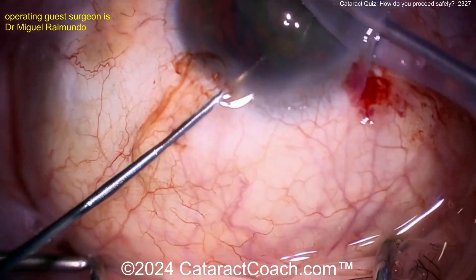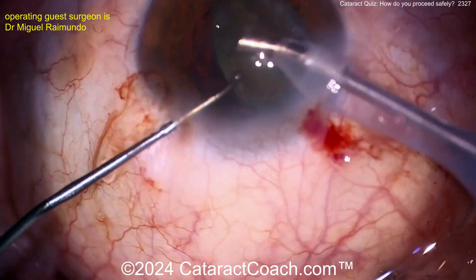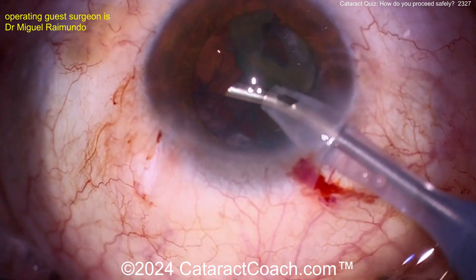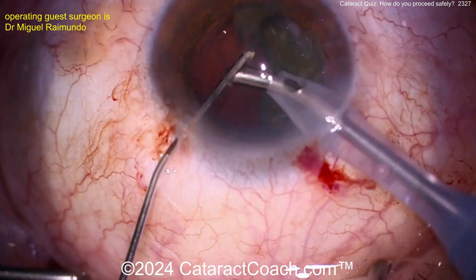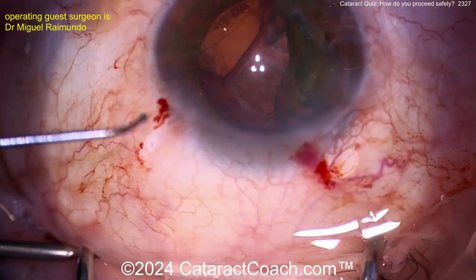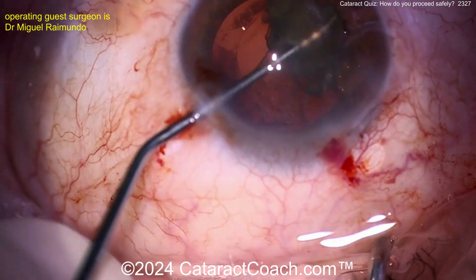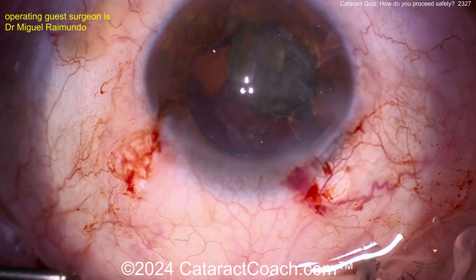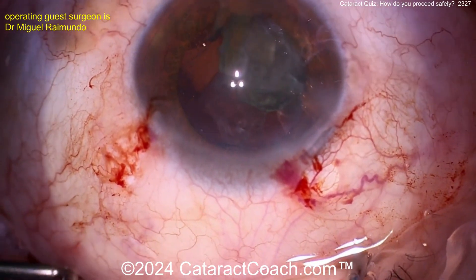Put the phaco probe in the eye and wolf that thing down — vacuum only, vacuum vacuum vacuum. Don't give phaco power, just vacuum, because if you give phaco power it'll break off that piece. You want the whole shell to stay intact as one big shell. More viscoelastic going inside — viscoelastic is a great barrier. And there's your break in the posterior capsule — that's a significant break. Let's get the rest of that lens material out before it goes into the vitreous cavity.